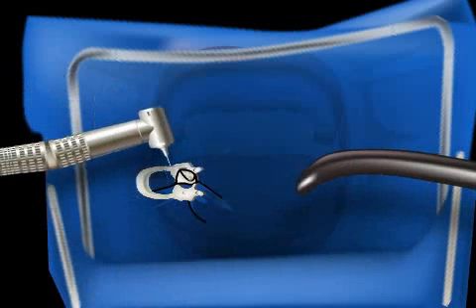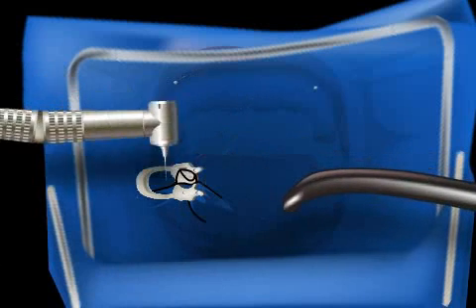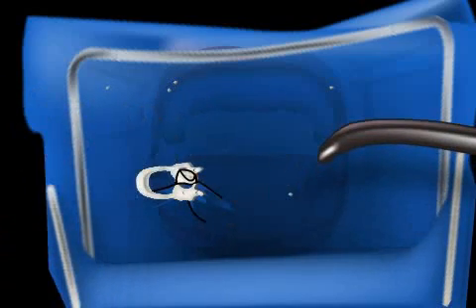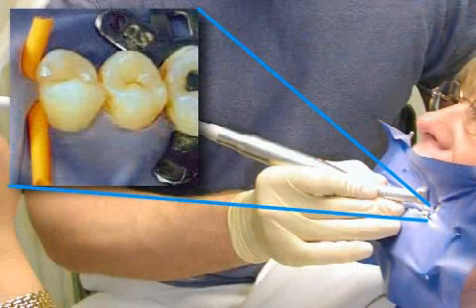As another example of the application of the dental dam, you see an amalgam excavation. For the most part, the amalgam cuttings and the fine amalgam dust are caught by the membrane. Thanks to the dental dam, the practitioner can concentrate on the work area with peace of mind and doesn't have to fight saliva, blood, or the tongue.